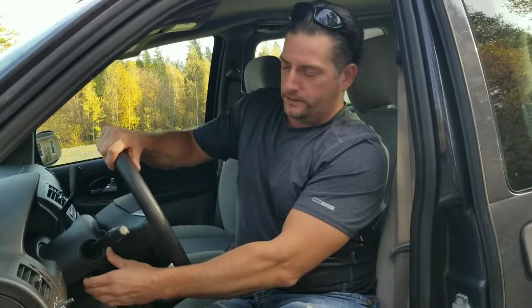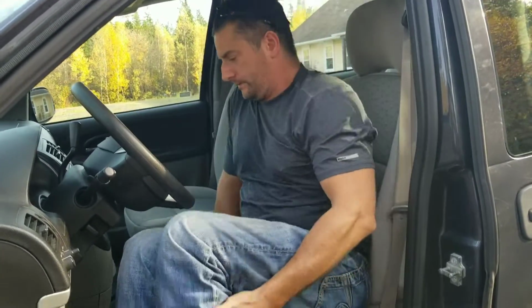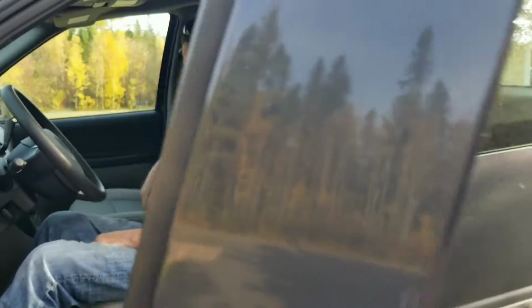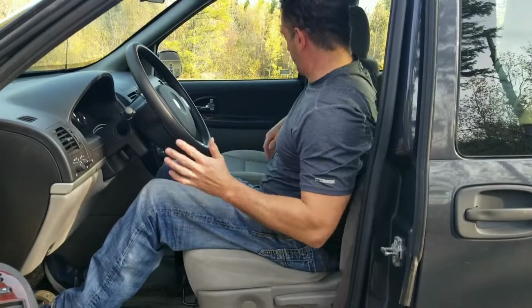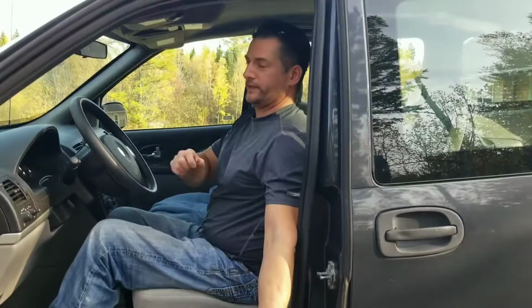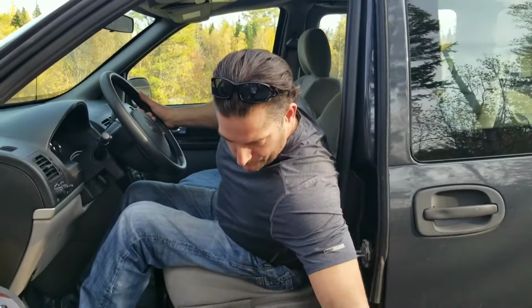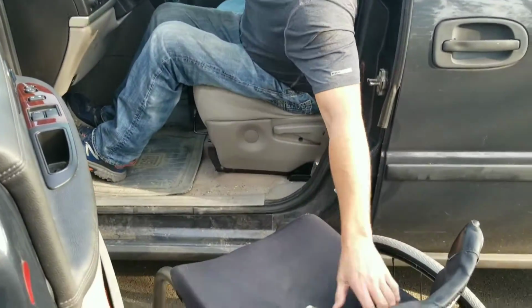Always, if you have a steering wheel that you can move up, shift your steering wheel to the upper position. It gives you more room for clearance for your legs. So there we go. Now what I'm going to do is lift my arm rest up. If you have a towel or something to protect the interior of your car, I suggest you put your towel out on your seat, because my old vehicle, when I was transferring this way, got beat up a lot. I was bringing the chair over my chest, it was hitting the top, and the grease was getting on the seat.